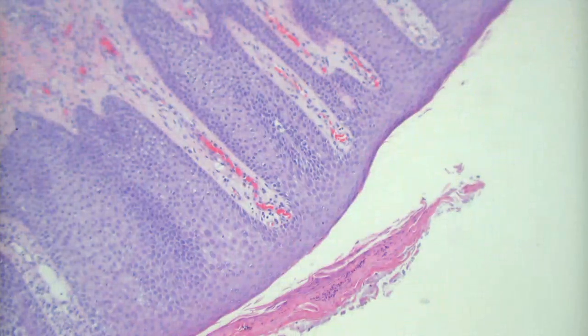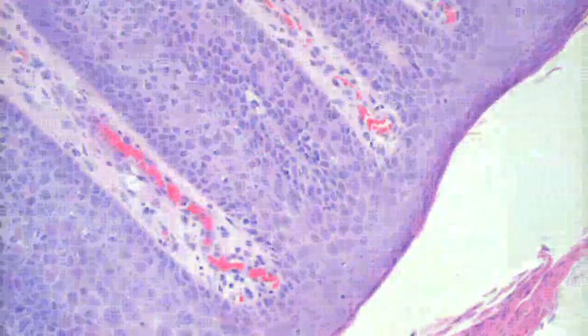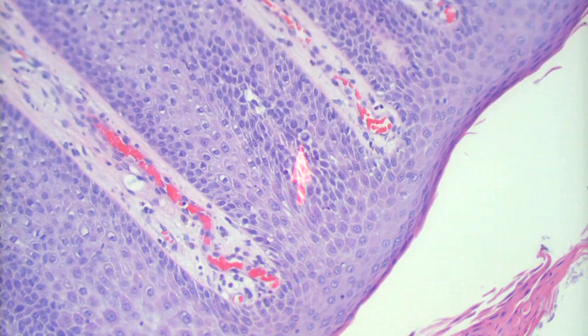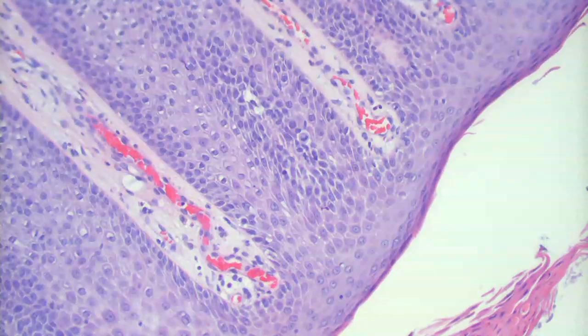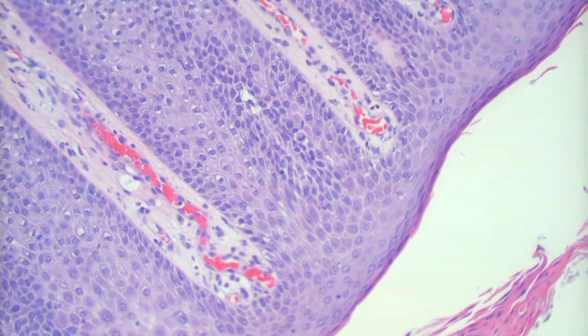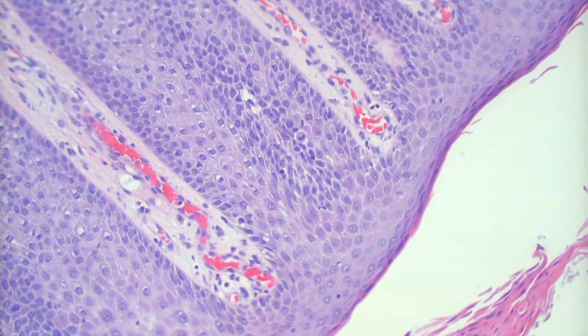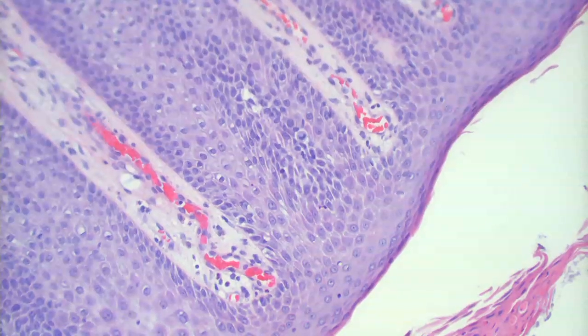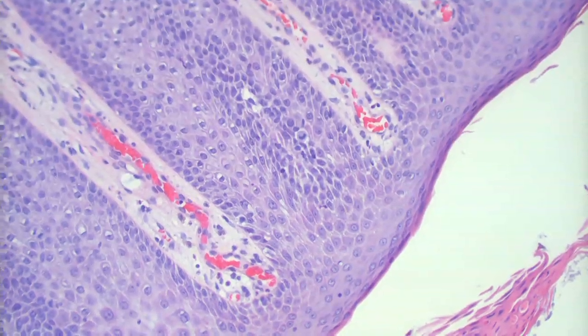So sometimes you have to use the overall architectural features. Here's a suprabasilar mitosis. That's also helpful when you're dealing with psoriasis and with spongiosis. And so most clinicians don't biopsy classic perfect examples of psoriasis. They can usually tell from across the room.